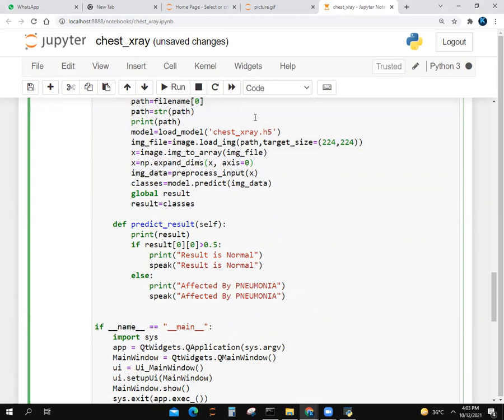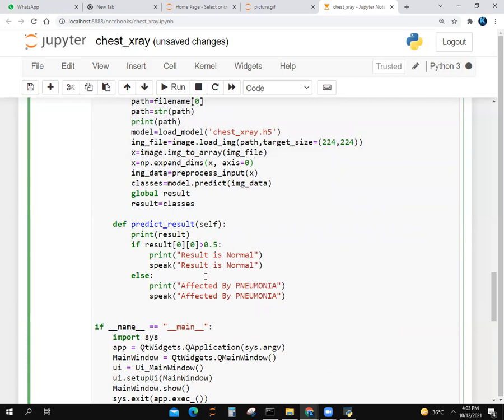We make a function with an argument. If result[0,0] is bigger than 0.5, the result is normal. Then Jarvis will say result is normal. Else, it prints affected by pneumonia. There would be a voice of Jarvis, artificial voice, and it will say you are affected by pneumonia.